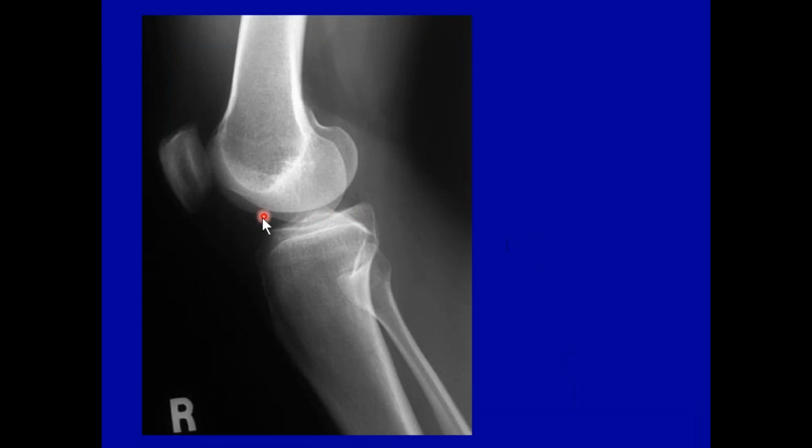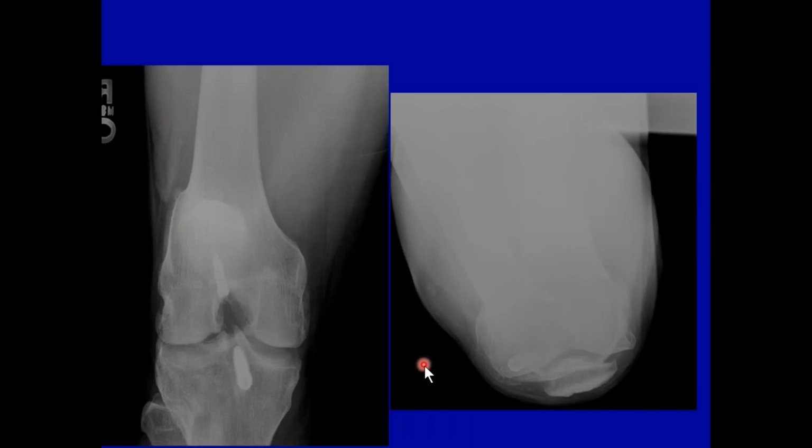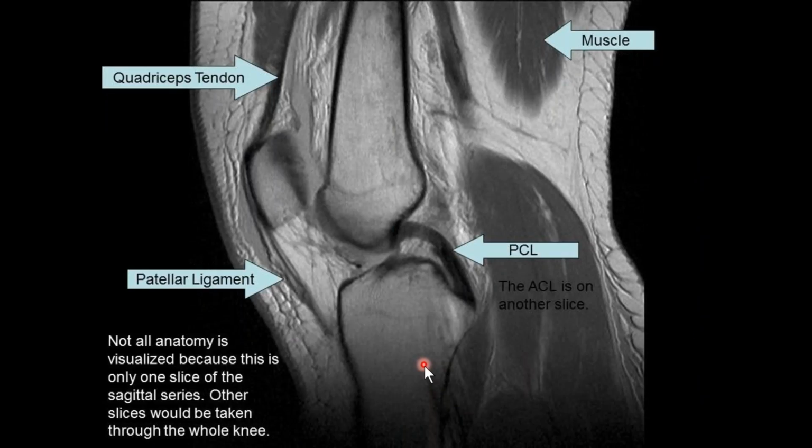Now let's just talk about this again. The patella is anterior, you know that. The epicondyles of the femur, tibia, and the fibula. As always, when we have a more sensitive examination with this, there's our patella, but now we can tell what's happening with these superficial tissues. And I said there's a bursa that we can see, not on this particular orientation, because we've now sliced the knee from side to side. If you think of our loaf of bread analogy, well, we can slice that loaf of bread from top to bottom. We can slice it from side to side, but we can also slice it from front to back. So suffice it to say we can see the bursa very clearly.